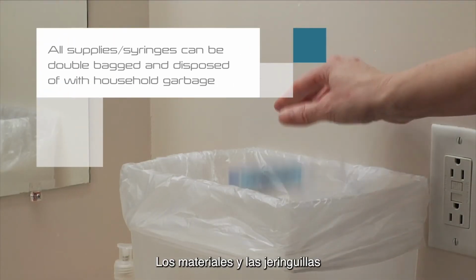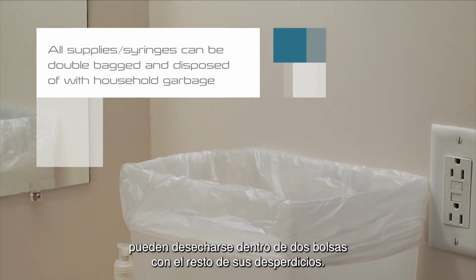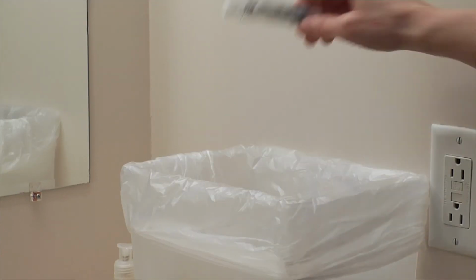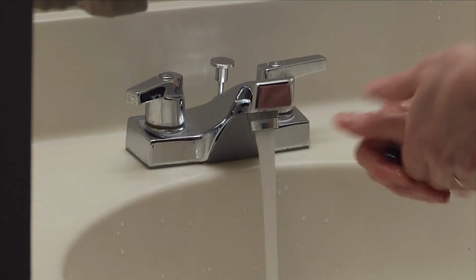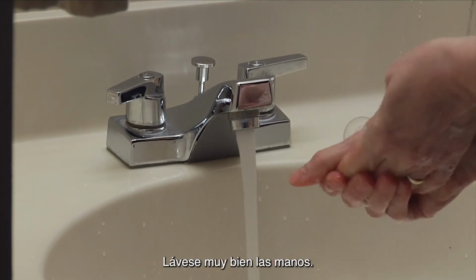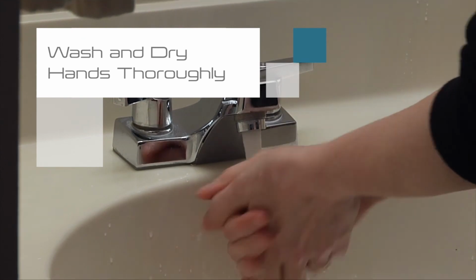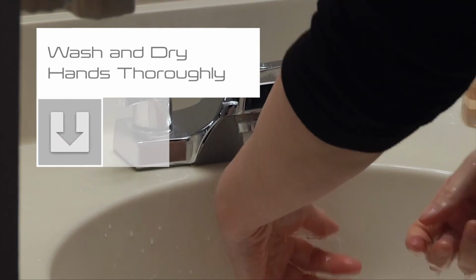All supplies and syringes can be double-bagged and disposed of with your household garbage. Wash your hands thoroughly. Properly administering IV push medication via pre-filled syringe using the SASH method at home is important to your safety. In the event of an emergency, always call 911.